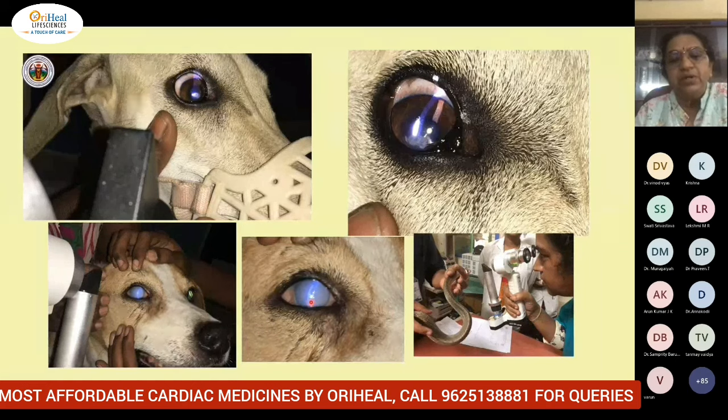That is why I said in the cornea, when you do it with an opacity, you get two lines here, and the corneal thickness also can be measured with the help of a portable slit lamp. It is a very highly useful piece of equipment which all of you should have in your clinical setting. The only thing is, you should try to gain experience with the equipment and develop proficiency in using it, then it will be easier.